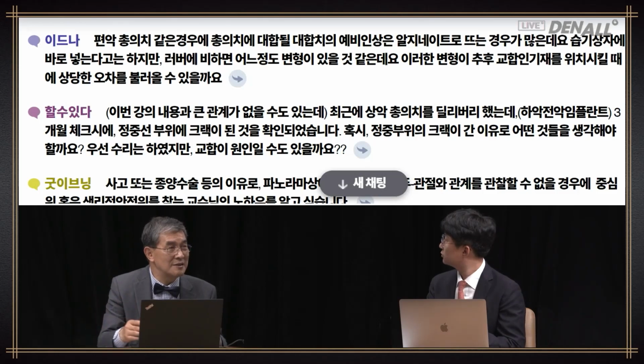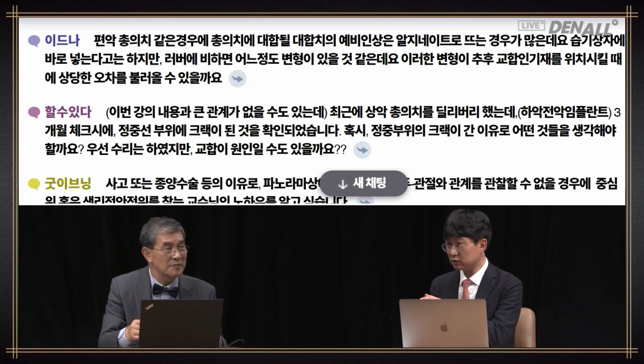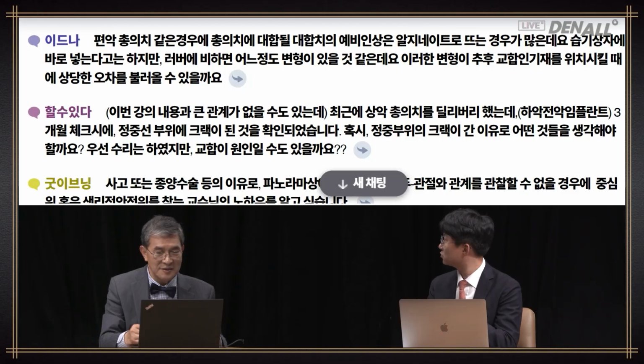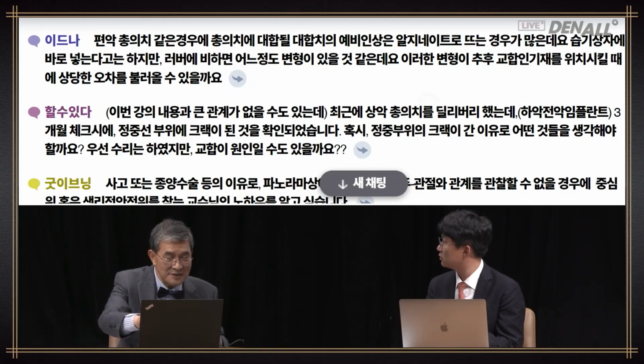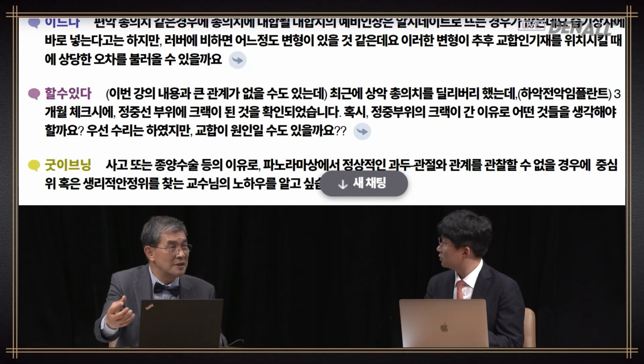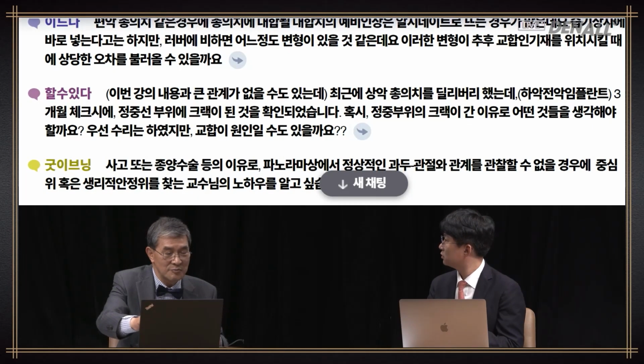Yes, even so, errors may occur, right? That may be the question. But I think more deformation is occurring at the beginning when it is removed. When the registration material is removed, it will not be affected that much. Is that what you're saying? So if it is put into the moisture box, the alginate impression will not pose a big problem.